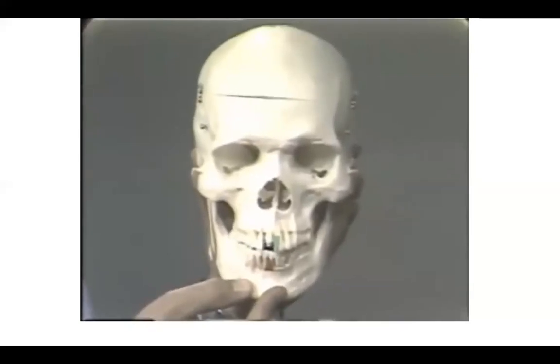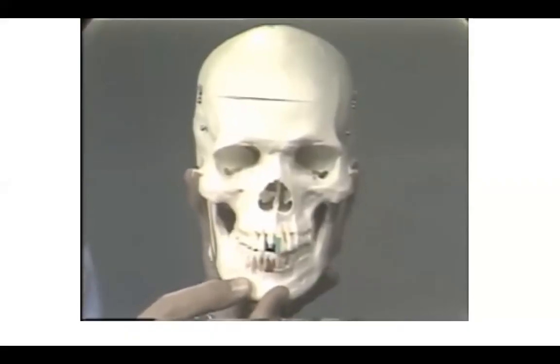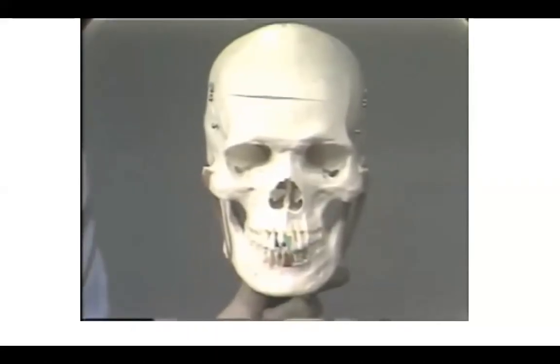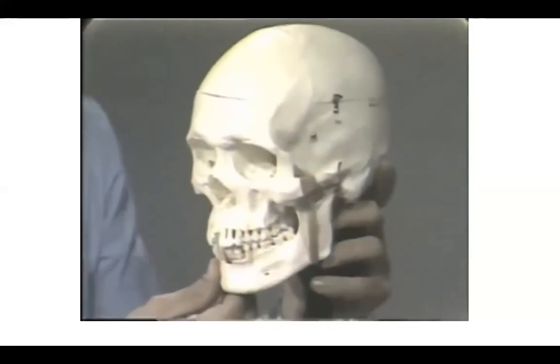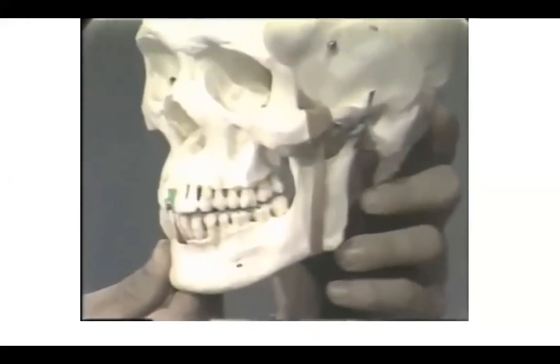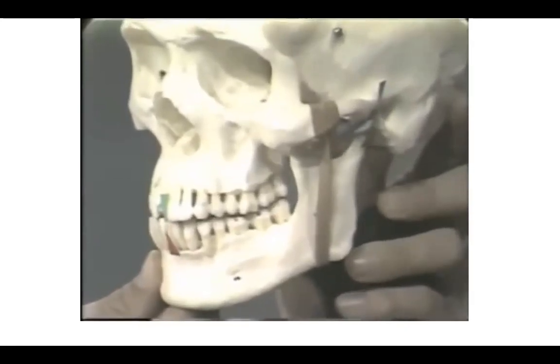Now, the condyle on that side is coming down and forward and to the medial aspect. Now, we're going to have to get the skull in a little different position so that we can look at that balancing condyle. You can see the balancing condyle coming forward. The balancing condyle is coming forward as well as moving medially.